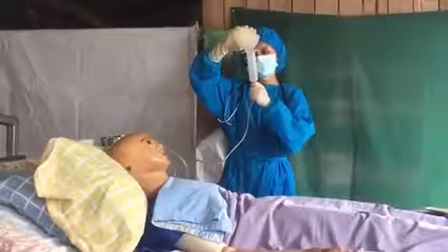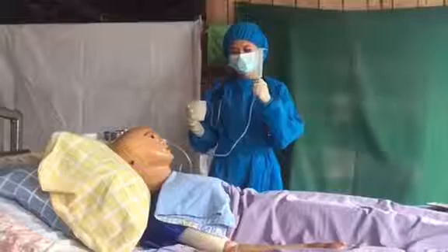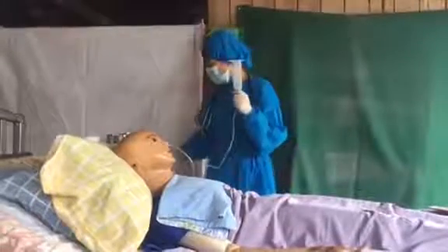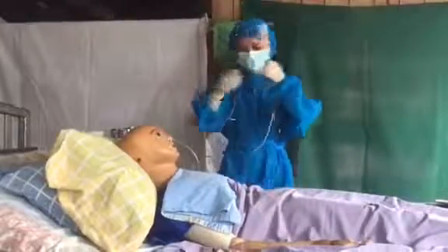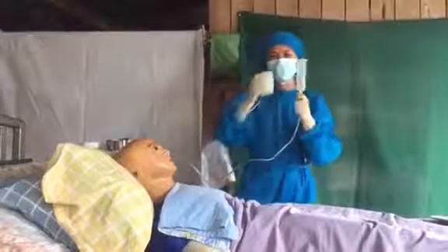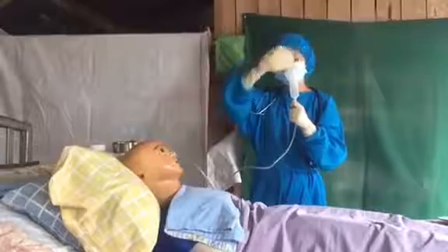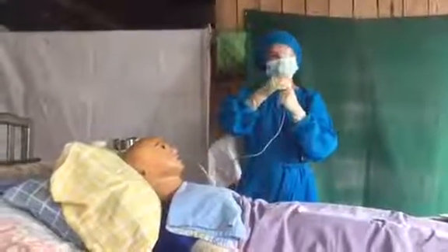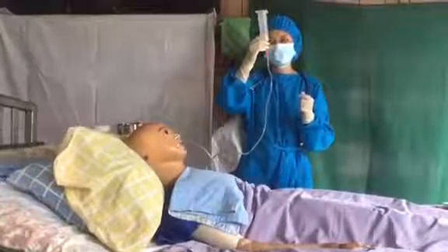And then introduce 30 cc of water or plain normal saline solution. And okay, so do not empty the asepto syringe.